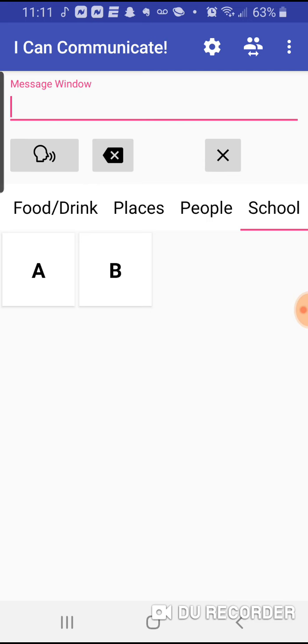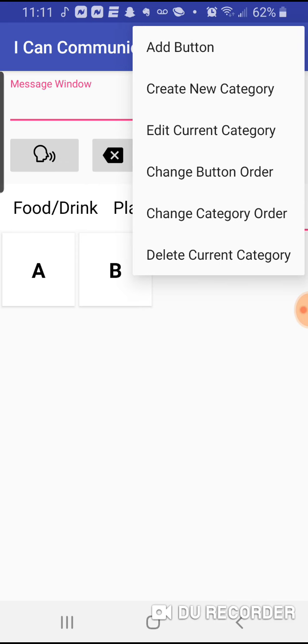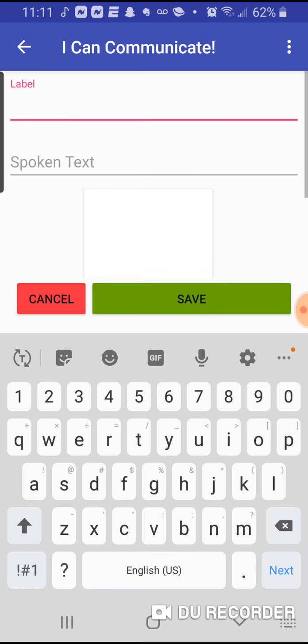And to add to the category, as I showed you before, it's very simple. You just hit the add button.